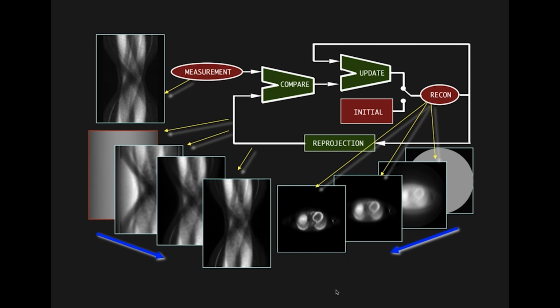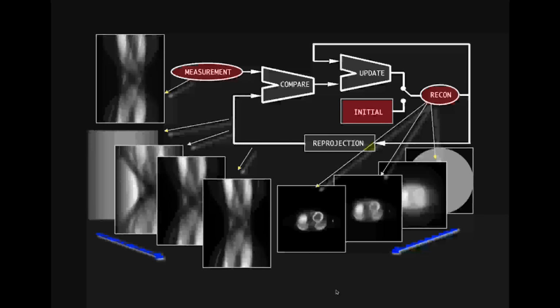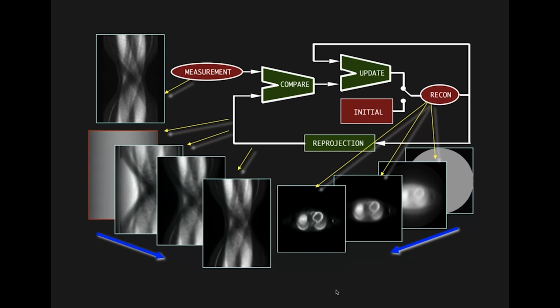Now, what happens in hospitals is that with CT scanners, because CT scanners are technically quite okay, most often we still use the filtered back projection. So there are very few scanners that use iterative reconstruction. Except nowadays, for example, if we want to go to very low dose scanning, so if we want to reduce the X-ray dose in such a way that we have a lot of noise in the images, because if our original intensity is too low, then we come into the noise level of our whole equipment, then of course we need to do iterative reconstruction.